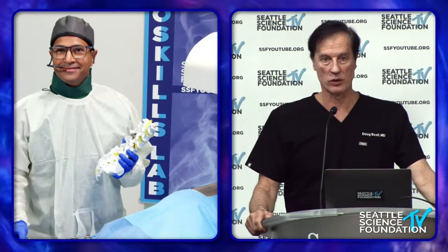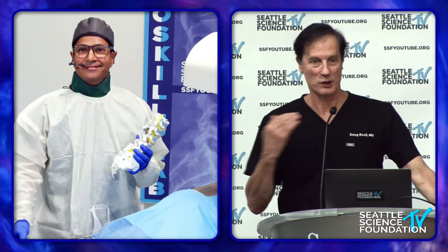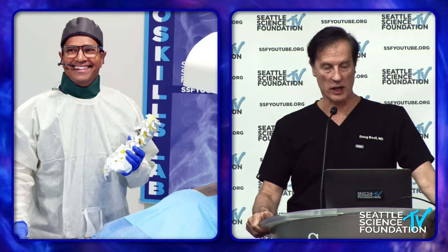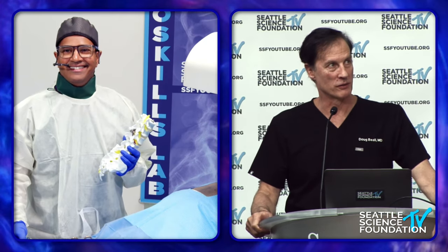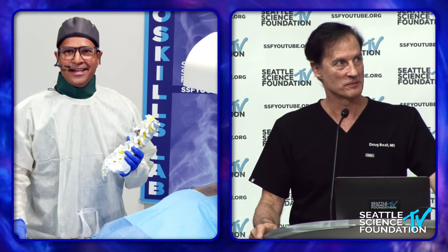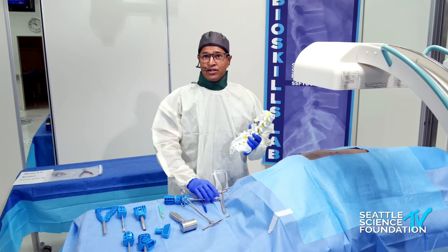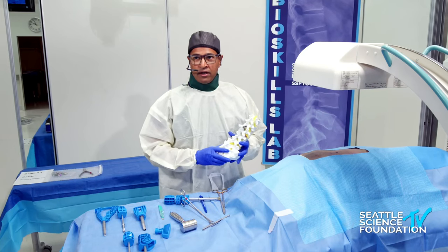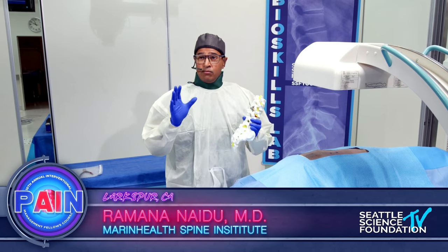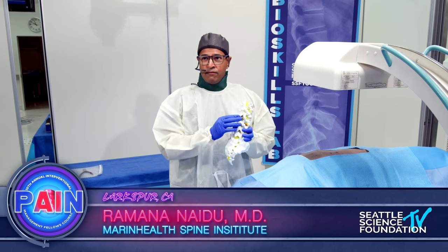We're going to transition over to the lab now. Dr. Naidu is going to be discussing the Vertiflex interspinous decompression spacer. Thanks Doug, and thank you for giving us a great lecture on the radiological confirmation of lumbar spinal stenosis. So real quickly, the purpose of the Vertiflex spacer is to be an extension blocker.